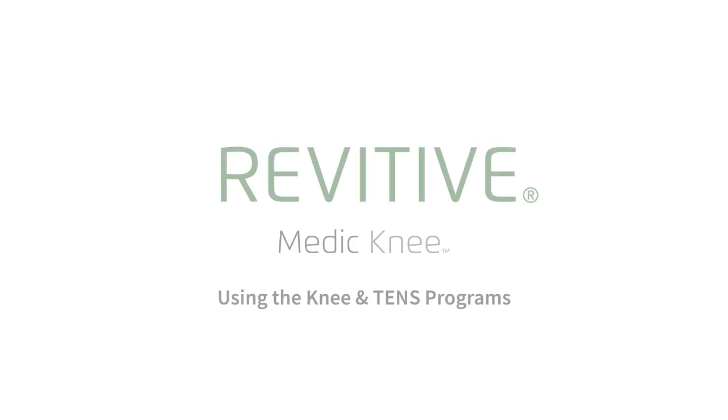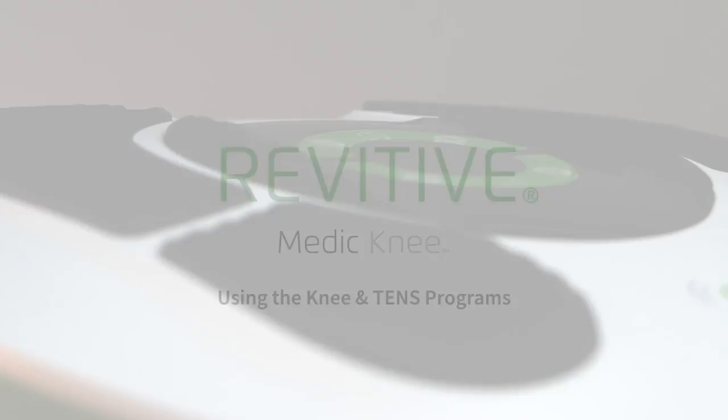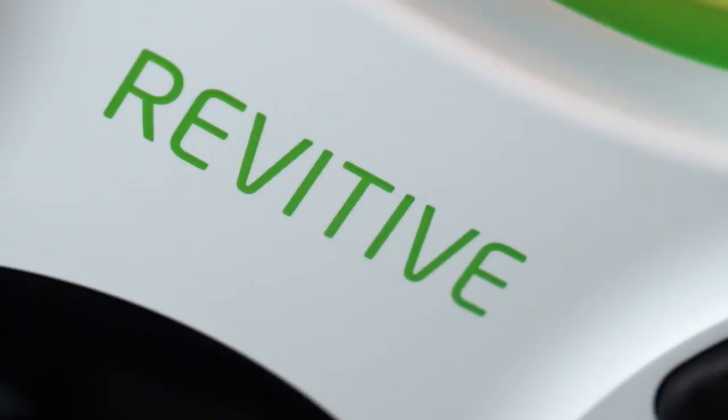Thank you for joining us. This video is part of a series that we've made to help you set up and use your Revitiv Medic Knee. In this video, we'll show you how to use both the Knee Program and TENS Program.